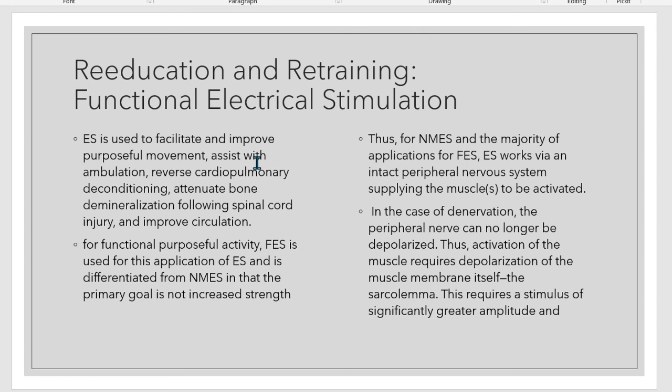It must be abrupt, to avoid adaptation of the muscle to the current. So the intensity should be increased abruptly. That is for denervated muscles.